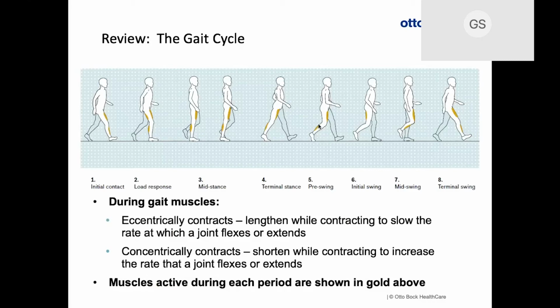And that's why I think orthotics has changed so much. It's not about stopping and locking and popping. It's about allowing certain dynamic motion and allowing it to occur in a very physiologic way. So this emulates, in a sense, when we use carbon, when we use other types of components, this allows it to emulate this eccentric contraction.